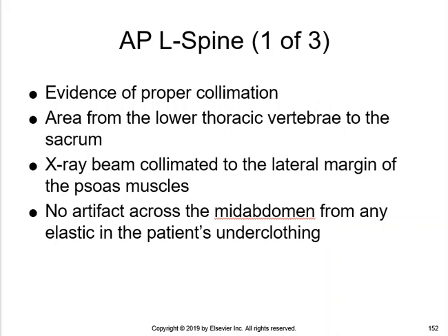The collimated field should not cut off the psoas muscles, and we shouldn't have any kind of artifact across the mid-abdomen region from the patient's pants, or if they're wearing yoga pants, or if they're wearing jeans, the snaps or the buttons or the zippers should not be in the way as well. So I really recommend that what you do is dress your patient or put a sheet over the patient and just have them lower their pants down to about mid-thigh. And it's very important to cover them first, because sometimes your patients will get undressed right in front of you.